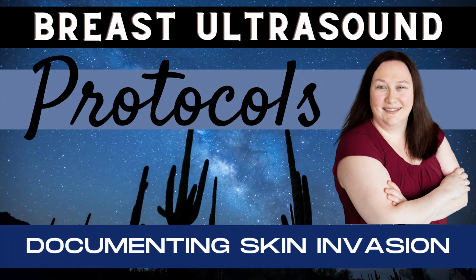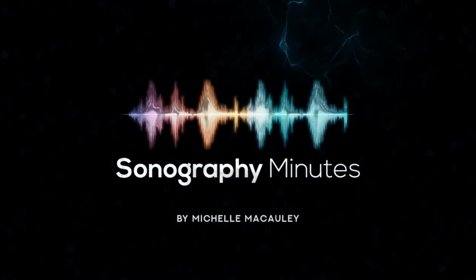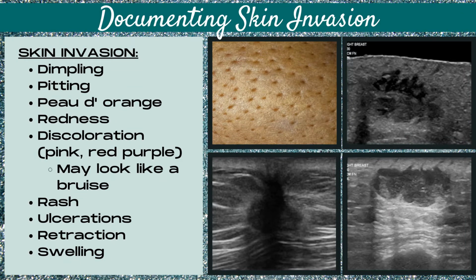Let's document. Join me as we cover breast ultrasound protocols on today's edition, Documenting Skin Invasion. Let's talk about how to document skin invasion.